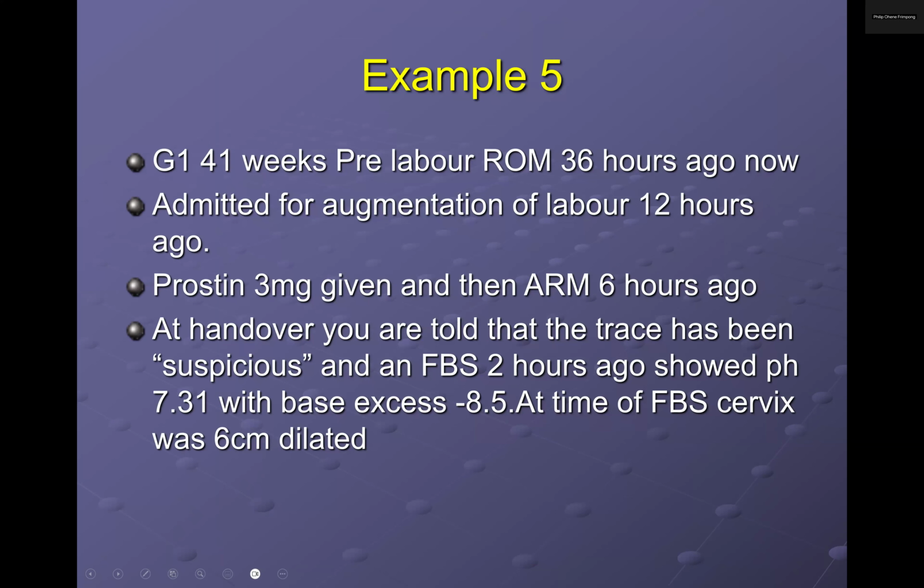Okay. So for sure, she needs to be re-examined. Yes. Maybe those decelerations are because the head has descended, and maybe she's fully dilated. In that case, you ask her to push. And given that it's her first baby, you might need to help her with an assisted delivery. But if she is not fully dilated, then we'll have to expedite.